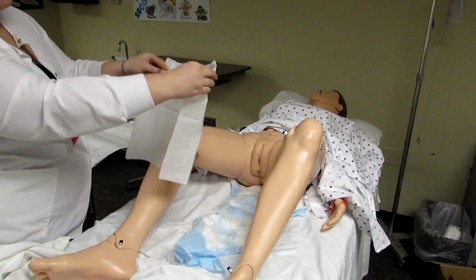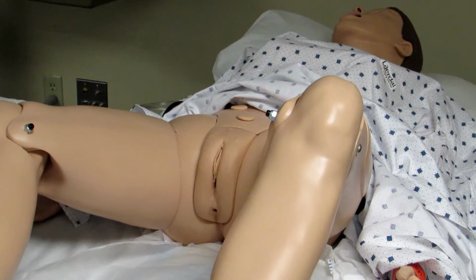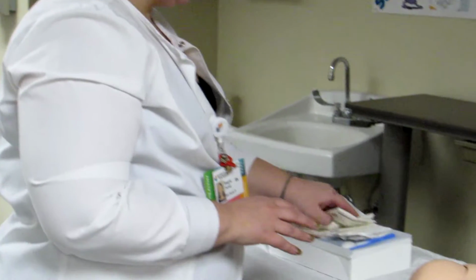I'm going to tuck it under here, and I'm going to sneak it right under her buttocks. You can ask them to lift up their buttocks if they can. Otherwise, just get it under there. Again, remember that drapes are primarily used just to help decrease the amount of microorganisms that are present in the general vicinity. Next, I have my sterile gloves, so I'm going to place those on.